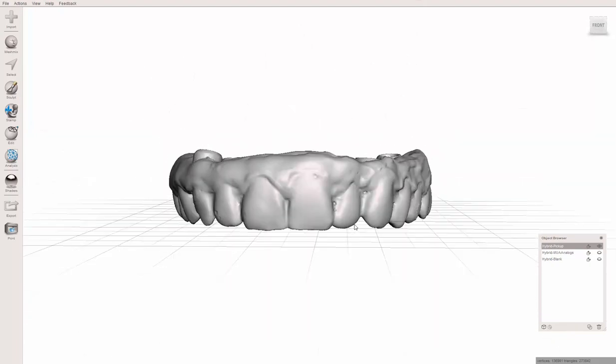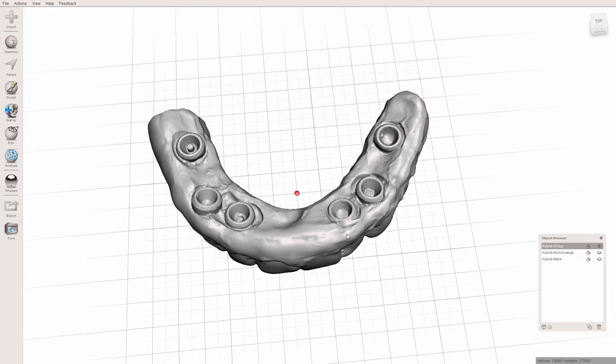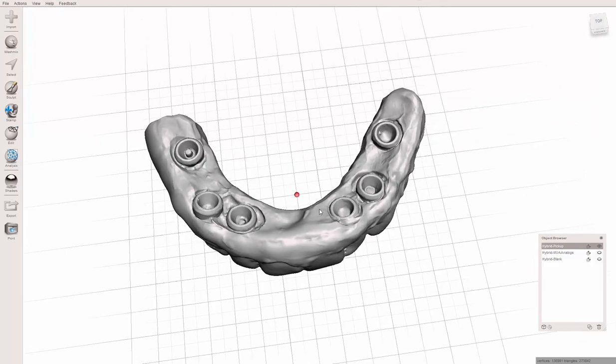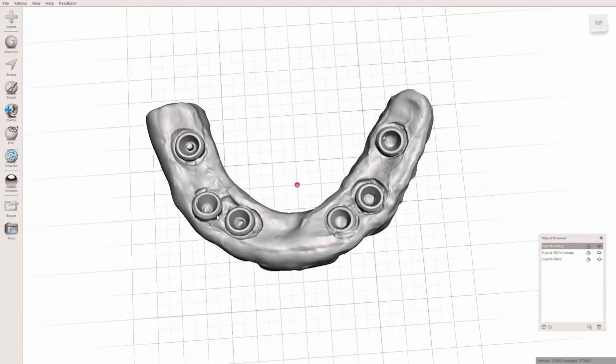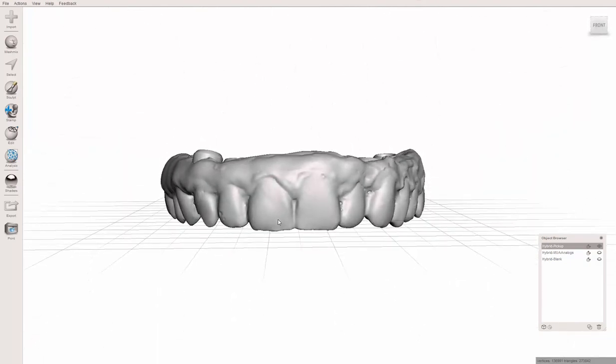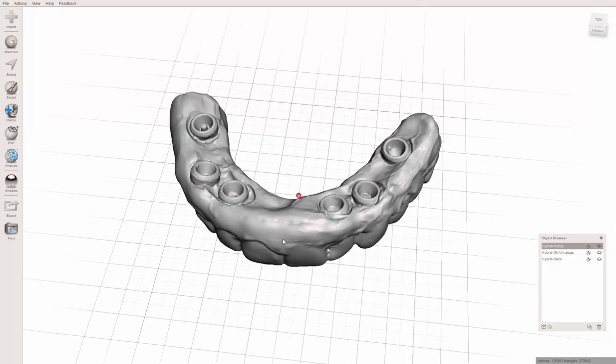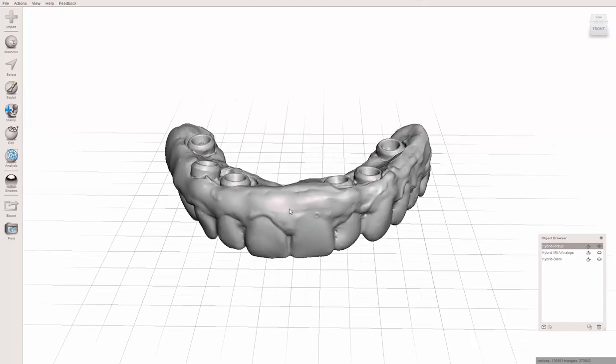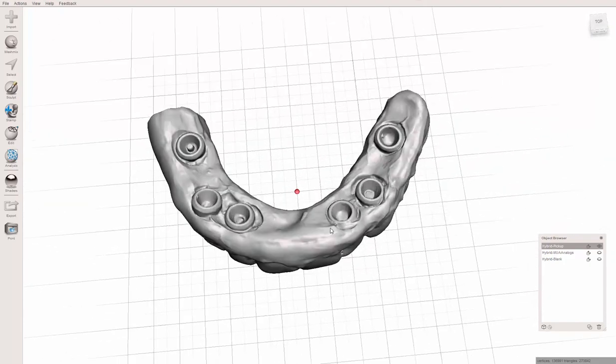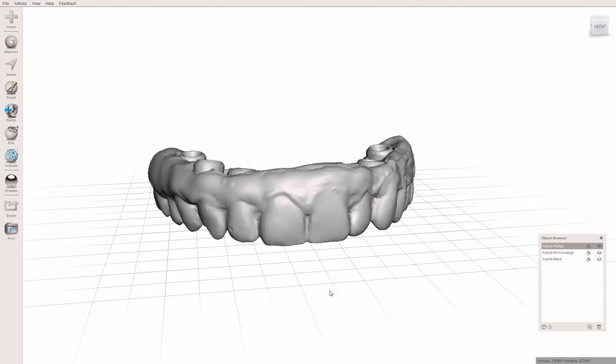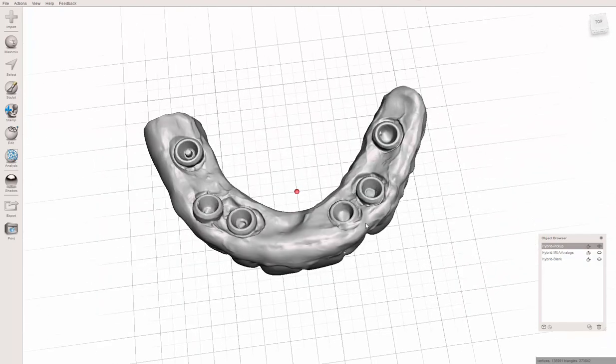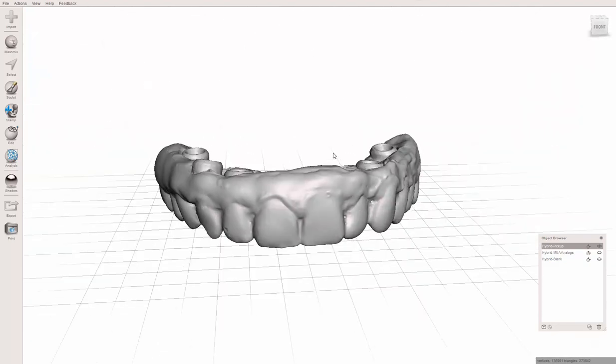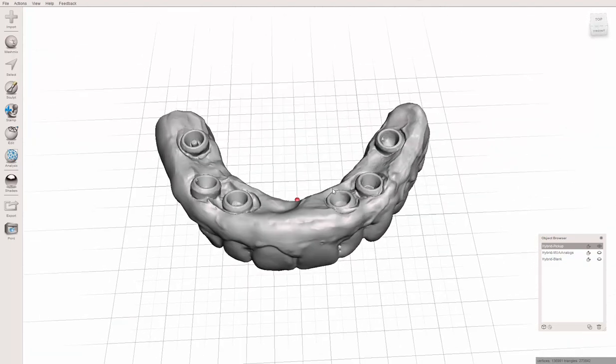So here is the patient's hybrid. This is a quick pick up, not perfect, but for the purpose of this video hopefully it's sufficient. This was a hybrid with the multi-unit abutment housings that were picked up in the denture with acrylic. You can do this with a desktop scanner, but most people don't have desktop scanners in their offices.